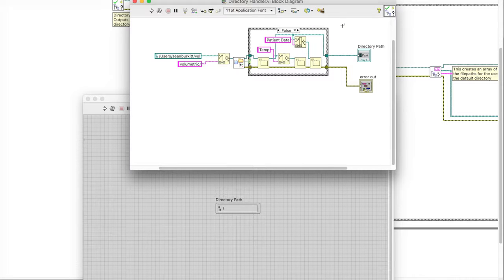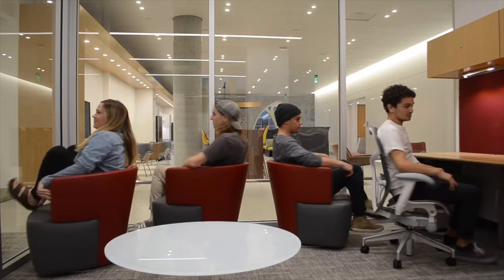We also designed a user management system that associated their data file with their profile in the program. We do this by setting up a directory within the user's computer and reading those files to strip the names from the file and use that as the profile name. This sub-VI automatically checks whether the directory is inside of the user's computer or not, and if it finds that there is no volumetric directory, it creates the architecture of subfolders, such as the patient data and the temporary data cache.